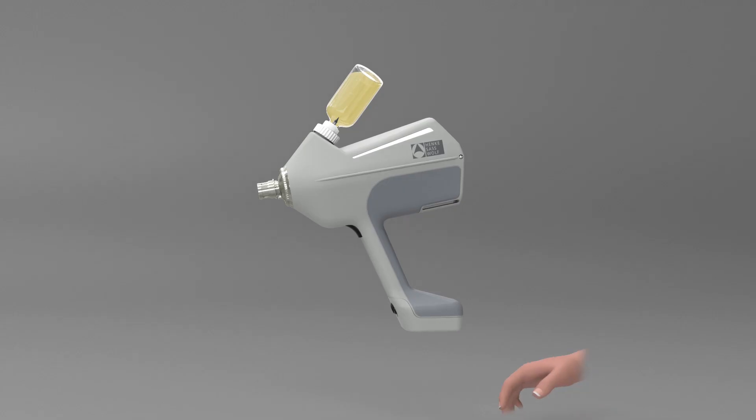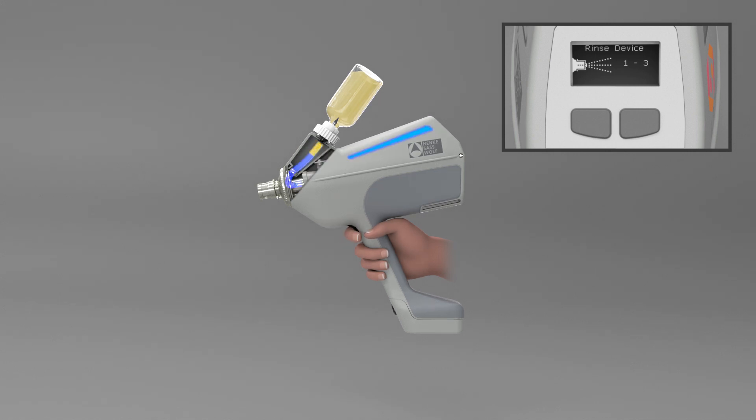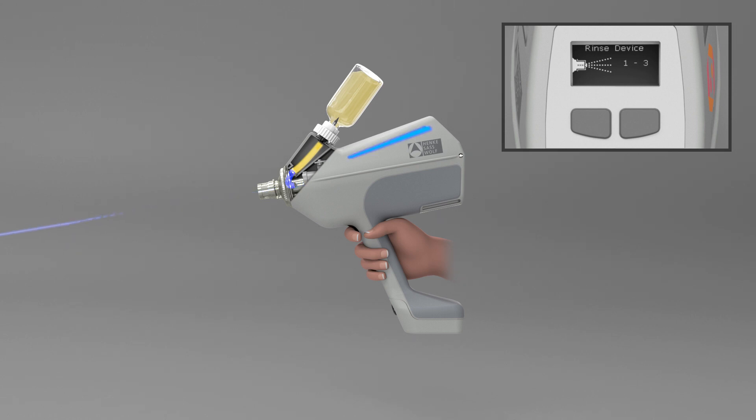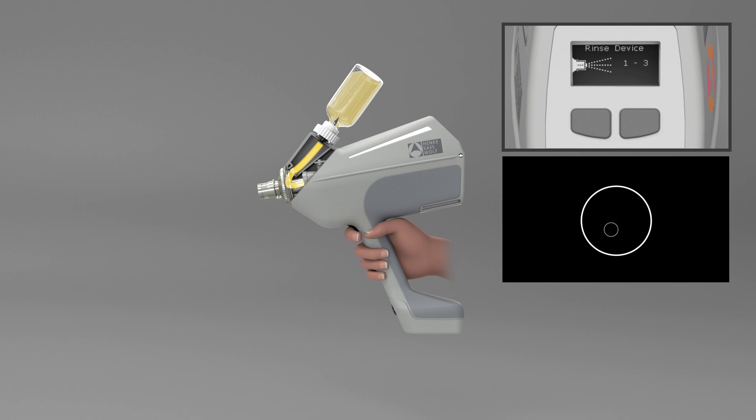After choosing your settings, push the trigger to prime the device with vaccine and rinse out remaining service fluid. This is done by three successive priming cycles, which are signaled by blue LEDs and during which the trigger must be held down.